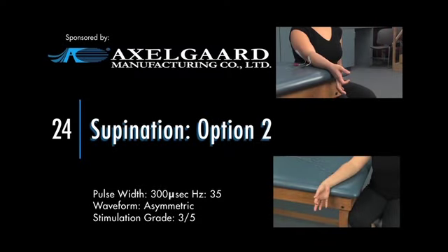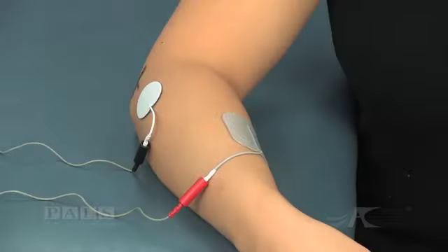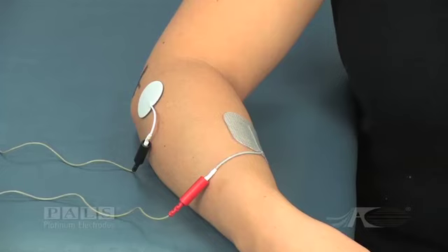Supination, Option 2. Electrode placement for forearm supination, Option 2.